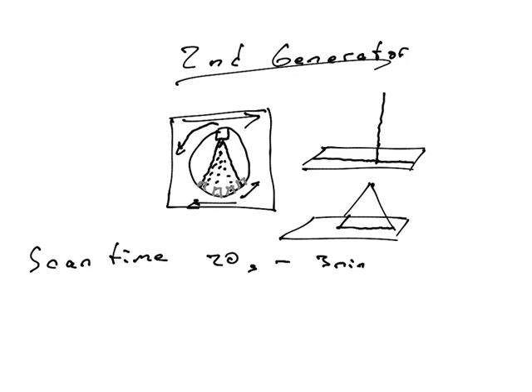Also, with advances in computer science at the time, in computer languages, they were using Fortran, and then they started using machine language and other things. The ability for the computer to do the calculations increased exponentially. Computers weren't as expensive. You didn't have to have a big old huge private room that held one single computer that had to be cooled. You didn't have to have such a big supercomputer. Now you can have a computer in the hospital room itself. It didn't have to be sent off to wherever the fancy computer was.